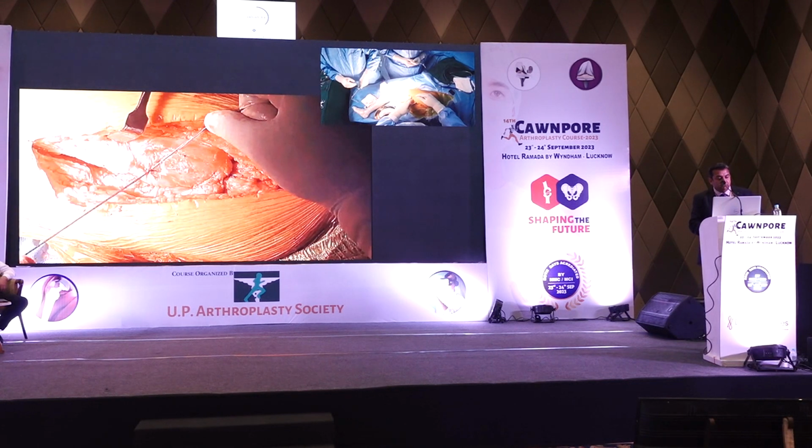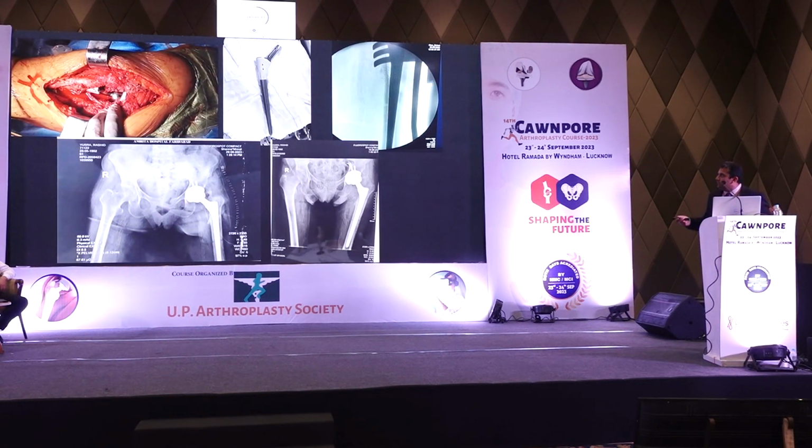Thank you. So this was the final X-ray of the patient. This was the intraoperative picture. This was the stem used. This was me checking on the table that I've got a snug fit. And these are the final X-rays of the patient. So see the screw is here of the PFN, and I've gone past almost 2 to 3 cortical diameters, and I've got a good fixation.